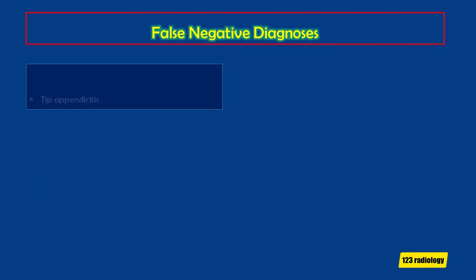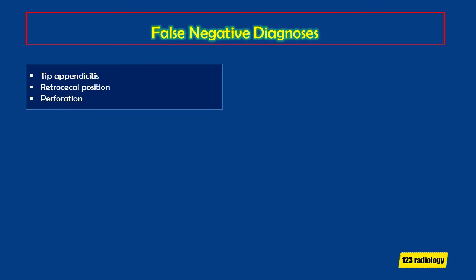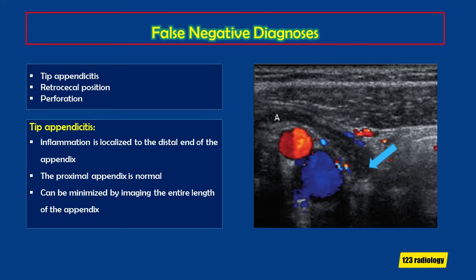Causes of false negative diagnoses include tip appendicitis, an aberrant location of the appendix such as a retrocecal position, and perforation. In tip appendicitis, the inflammation is localized to the distal end of the appendix, with the proximal appendix being normal. This pitfall can be minimized by imaging the entire length of the appendix. In this case example, the proximal appendix looks normal but the tip appears dilated at about 8 mm with increased echogenicity of the surrounding fat.